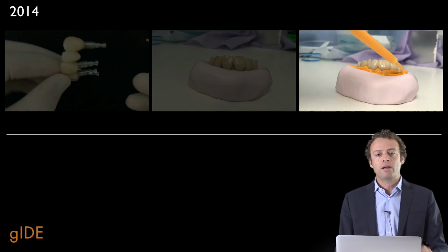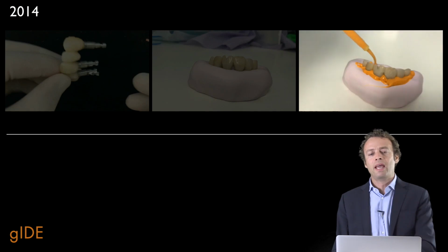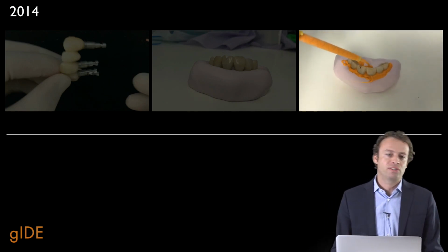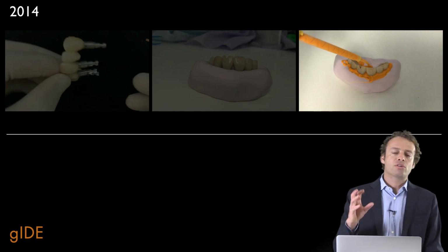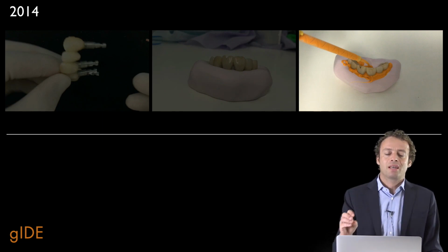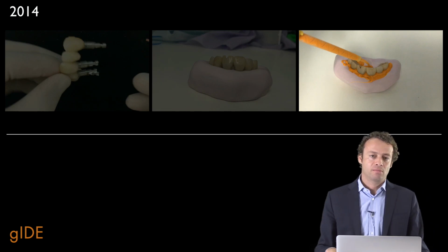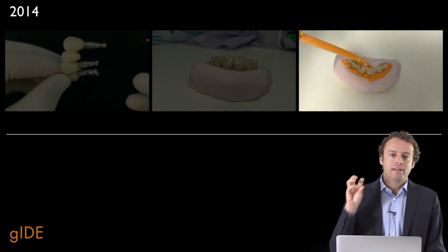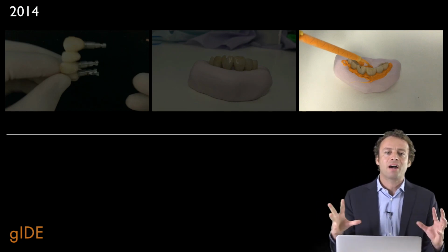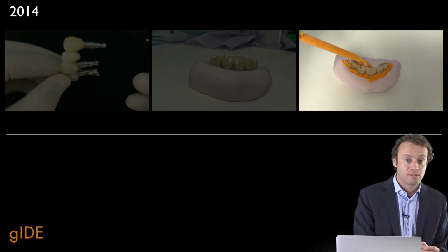In that way, we are able to create an ideal morphology. We are able to replicate in a really good way the anatomy and the volume of the temporary restorations. Of course, it's really crucial and necessary that the temporary restoration is ideal, and we have to spend time to idealize it, working with the patient, adding composite or removing some composite if necessary, because my target is to copy exactly what I have tested in the mouth for a month.